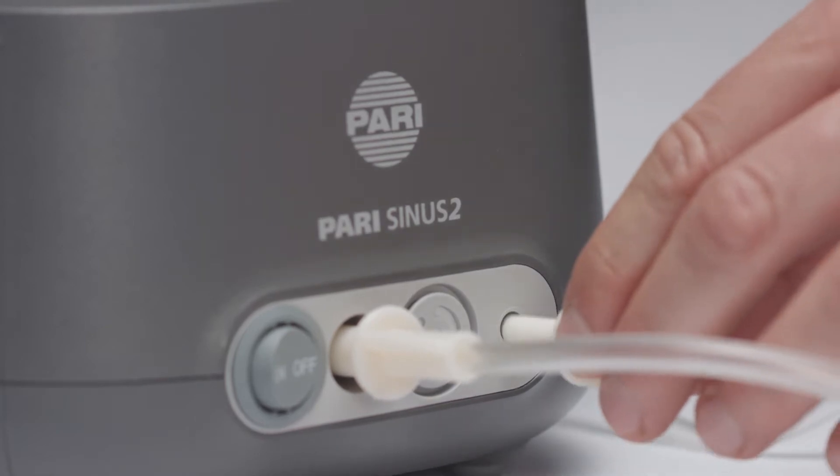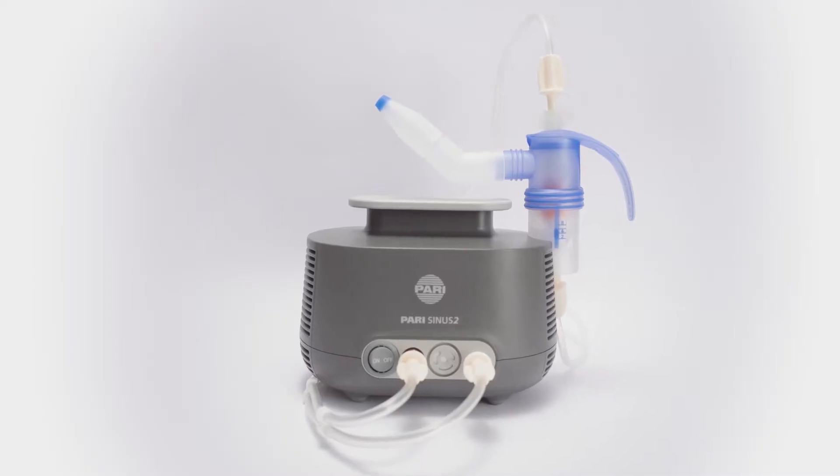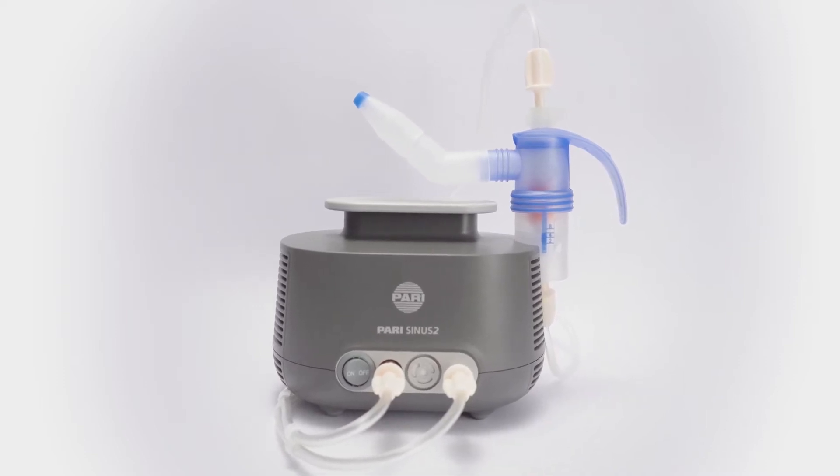You cannot do anything wrong — the tubing can only be attached to the fitting sockets. Your PARI Sinus 2 is now ready to use.